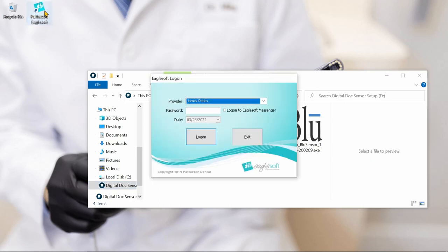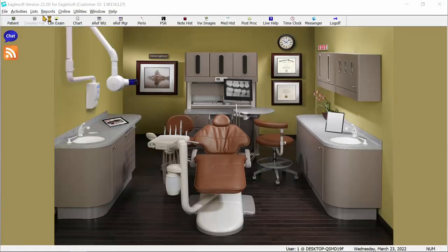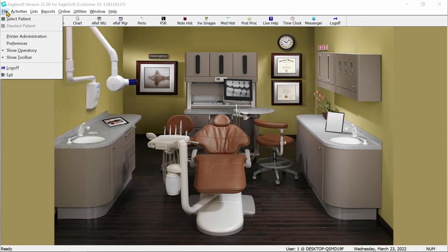Let's log in to EagleSoft. First, we'll go up to File and select Preferences.